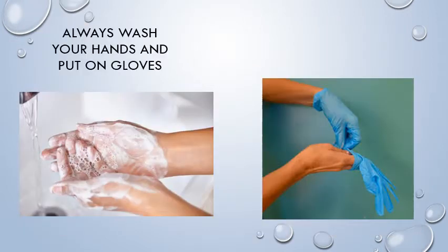Always wash your hands and put on gloves when providing supplement, medications, or water through a G-tube, and also when providing care to the G-tube site. When washing your hands, it is the detergent on your hands and friction produced by rubbing your hands together briskly that kills germs. The detergent must be in contact with your skin for 20 seconds.